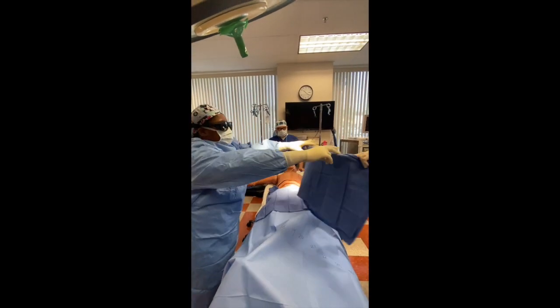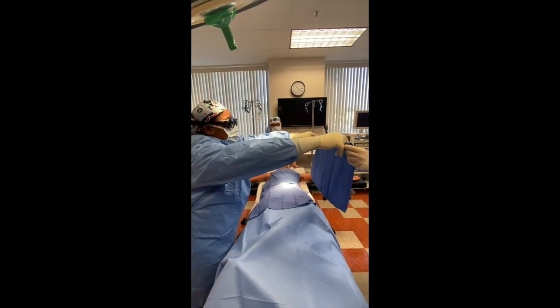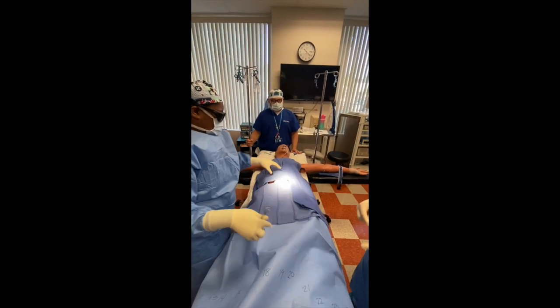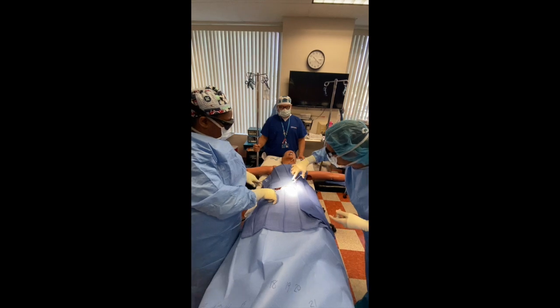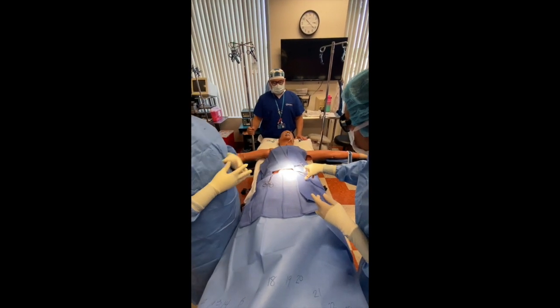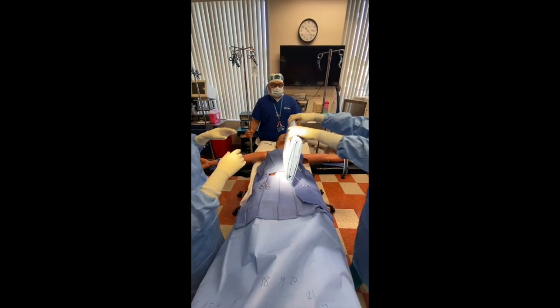You got some clips for me? I have four sharp clips for you. All the folds are down. Dr. Rulak likes towel clips. I don't. May I? Yes, you may. Thank you. I'm clipping towels only, not the patient's skin. Do they keep on or off, doctor? They can stay on for the university. Okay, we place it.